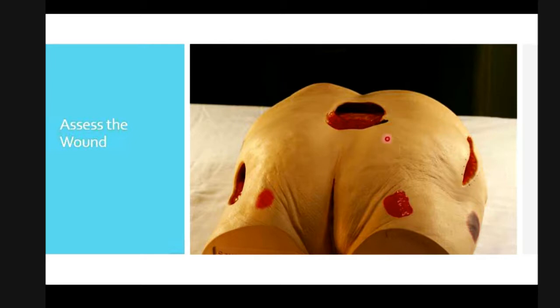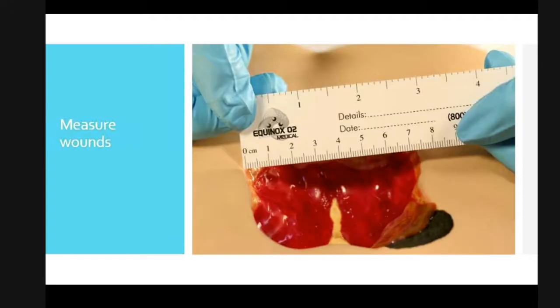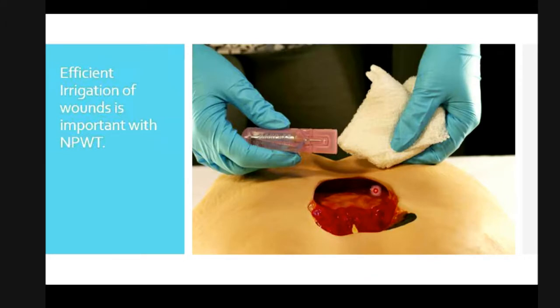We're going to assess the wound first to find out if negative pressure is appropriate and to look at where the placement is — whether we're doing a bridge or don't need a bridge. Here we have a wound that probably would be bridged. Use your measuring device to accurately measure your wound. You may also want sterile Q-tips so you're able to measure tunneling and undermining. Follow your facility protocol and irrigate both wounds, since here we are doing two different wounds.